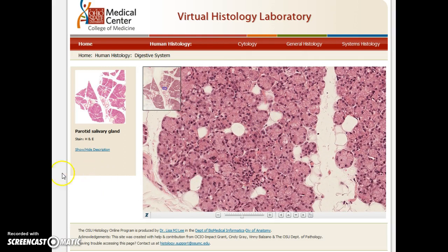So I hope this presentation helps you identify some of these structures of the upper digestive tract.